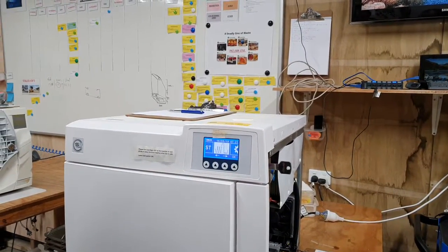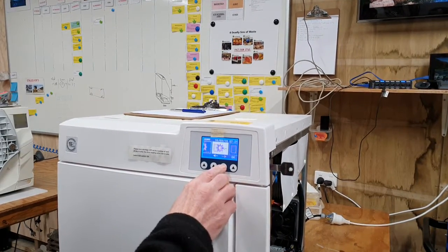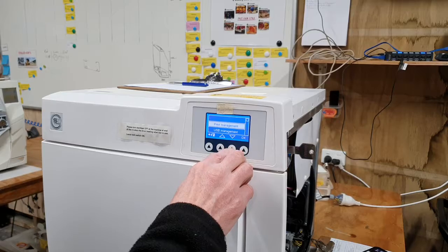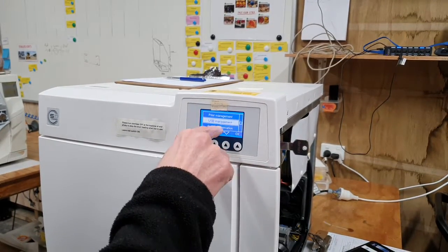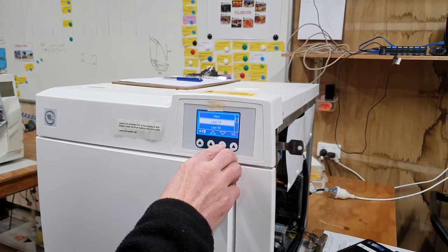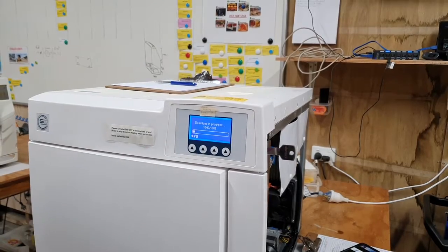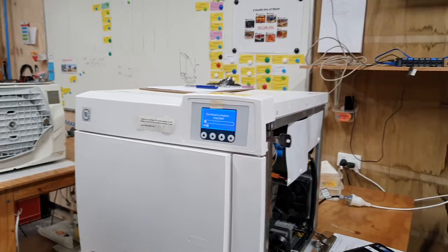It's acknowledged the USB stick, so we're going to come along here using these two buttons. So we're into USB management, and we press OK, and we want USB management here. So we went too far. So that's the one, USB management, press OK, and we want to go for the last 50, and then press OK. And it starts downloading.